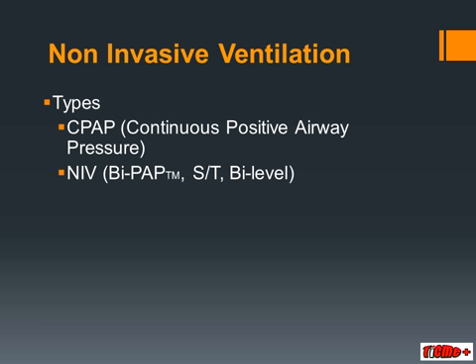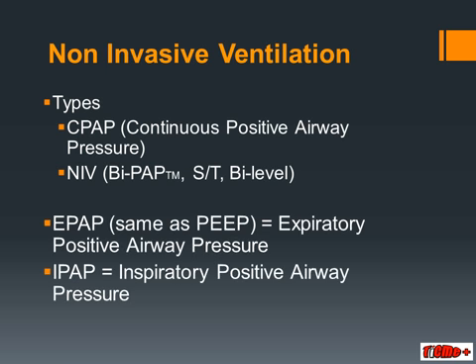Non-invasive ventilation, which has different trade names, some of which you might recognise as BiPAP or the S/T mode or bi-level ventilation, involves delivering inspiratory pressure support and then settling back to the EPAP value.